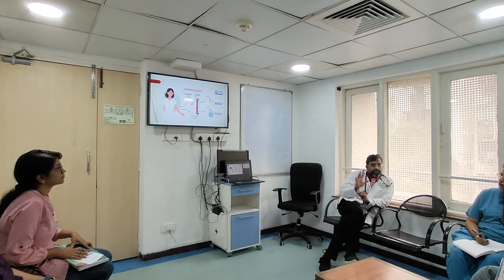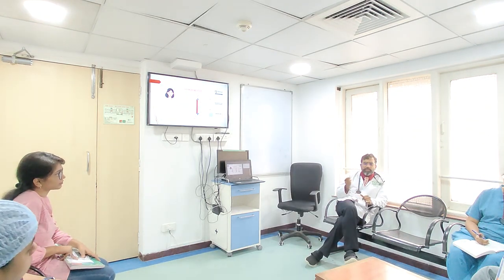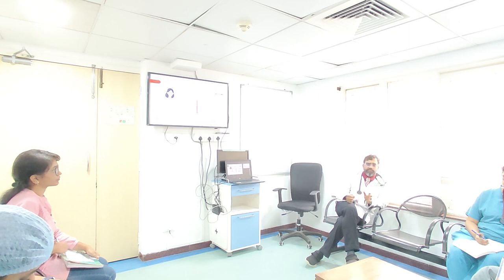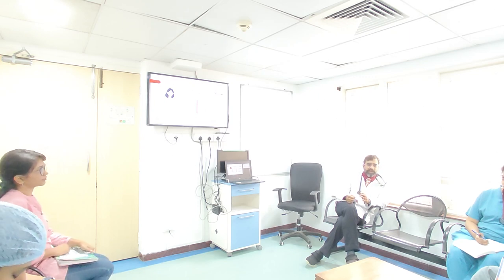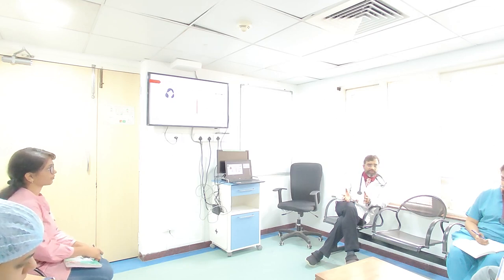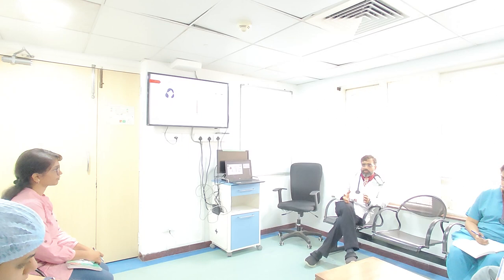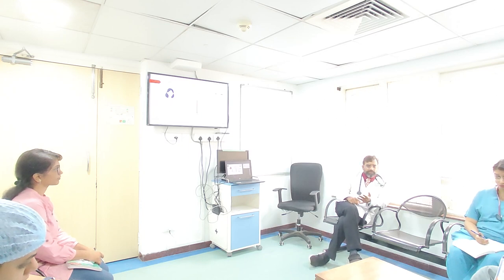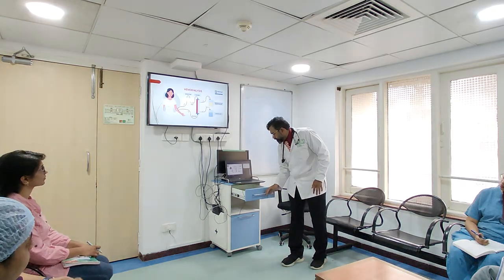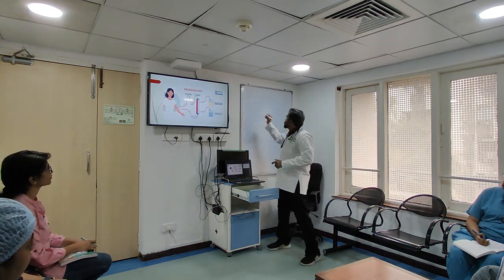So what is the difference between CRRT and intermittent hemodialysis? One mistake that people normally make is, say you have reached 2 hours of this hemodialysis, and then suddenly you decide that the patient has got more fluid, and you decide I want to increase the fluid removal. So say your initial target was 1.5 liters. Your dialysis was for a total period of around 3 hours, say for example. Okay, so you had a session of HD.